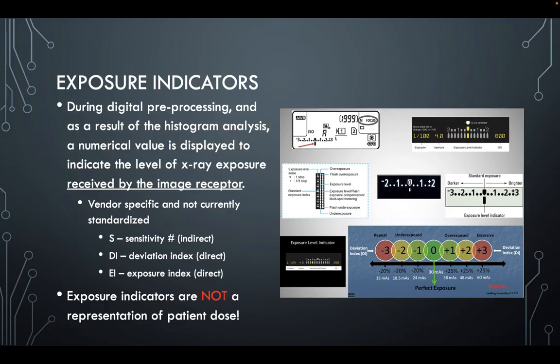And use your exposure indicators to help guide you. There are lots of different vendors, and vendors have their own exposure indicators. You've hopefully been exposed to a lot of different exposure indicators at this point, and what you will notice is that they're not standardized, they're all different.